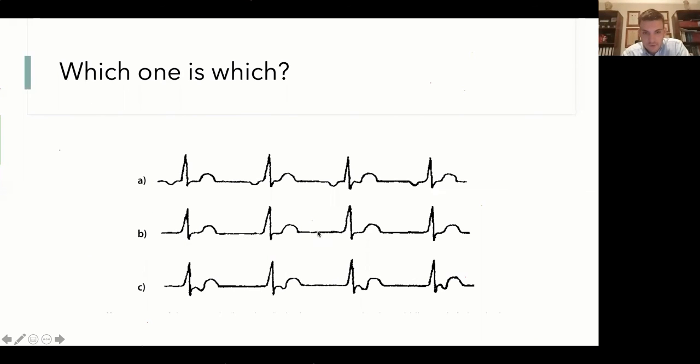No P wave, no P wave, no P wave. So superior, middle, and inferior. Why inferior? Because you can see the P wave here. It is after the QRS and before the T wave, in between the QRS and the T wave. Does everyone understand this? Does anyone have any questions? This will have a rate between 40 and 60, so it's usually slower, okay? But keep in mind that looking for the P wave in lead 2 will be enough to diagnose this condition. Look at its relation between the QRS and the P wave.